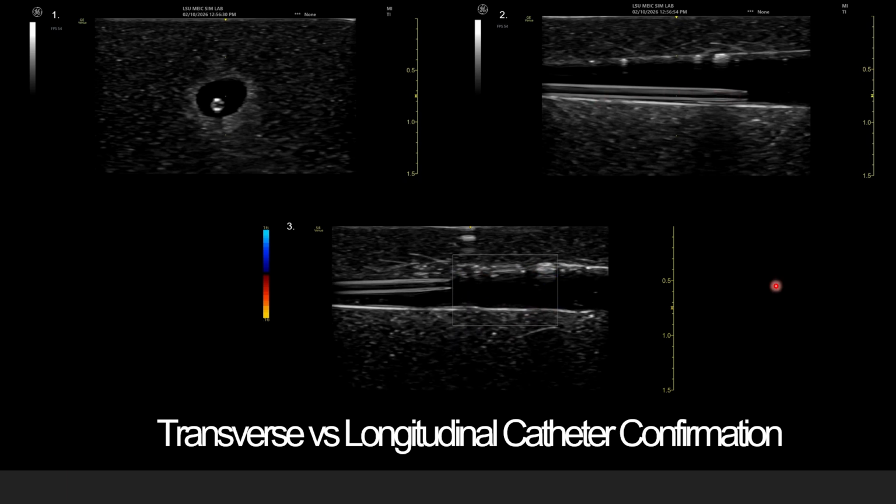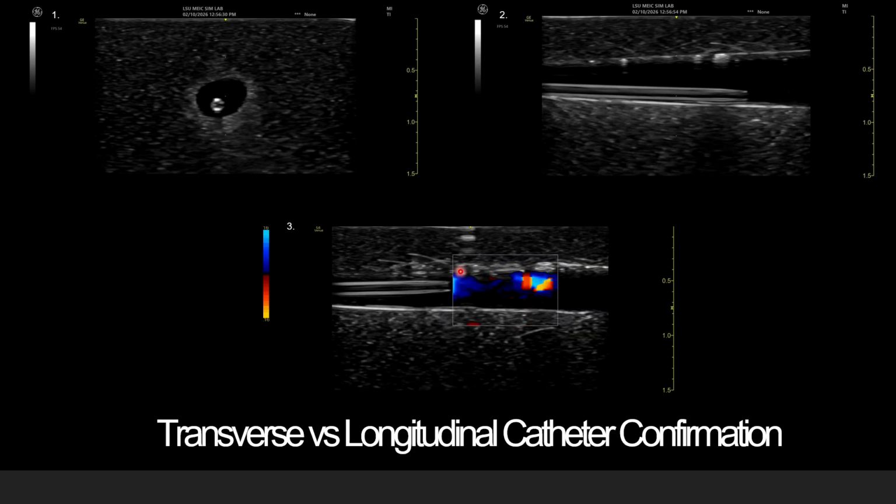So if we're worried about whether the catheter tip actually got outside of the vessel, or whether everything is flushing appropriately, we can pull up our color flow Doppler, because whenever we push that flush through that catheter, it's going to change the flow of fluid through there and we'll get a Doppler shift. So you can notice on this example, I put it just distal to the catheter tip. When I flush some of that saline through it, you can see that color flash. So now we know that our contents are staying within the vessel lumen.